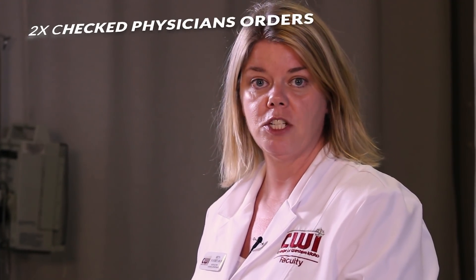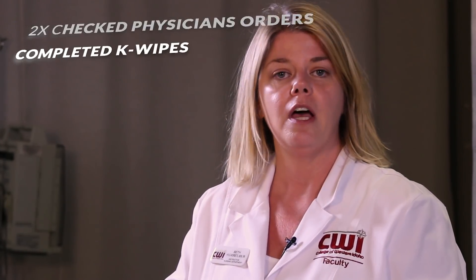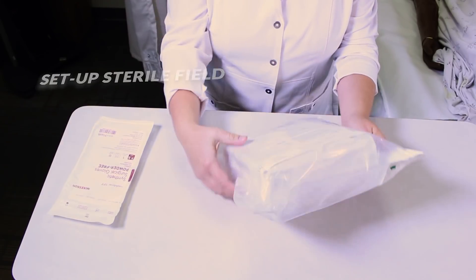The skill we're doing today is urinary catheterization on a female patient. I've double-checked my physician's orders, I've come in, I've completed K-Wipes, and now I'm going to set up my sterile field and get things ready for the catheterization.